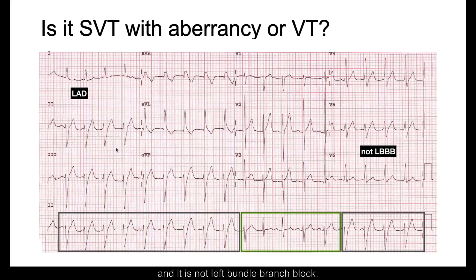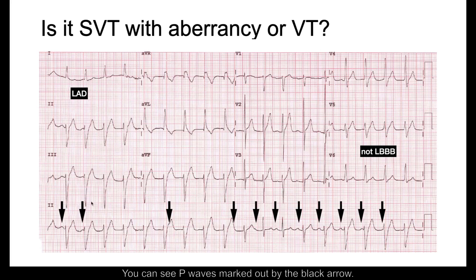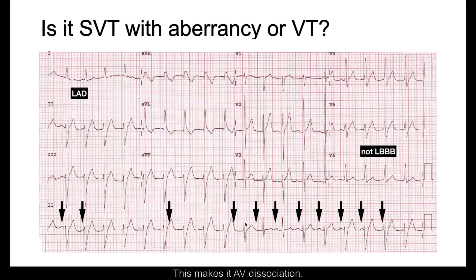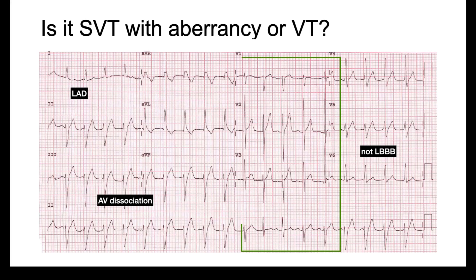A survey of lead 2 looking at P waves will show that there are P waves on lead 2. You can see P waves marked out by the black arrow, and it suggests that there are more QRS complexes than P waves. This makes it AV dissociation.